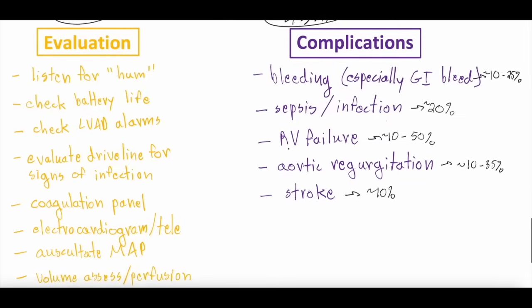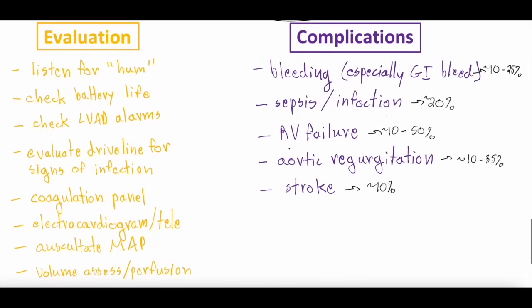All right, so how do we evaluate an LVAD? This is really complex, and this is certainly not a comprehensive list, but when an LVAD comes into the clinic, or you see one in the emergency department, and you are curious how to evaluate it, there's a handful of things you should do. The first is always to reach out to the LVAD team. They want to be involved. They follow patients with LVADs really closely. There's usually a coordinator on call 24 hours a day, depending on the institution you're at. Call the LVAD team, let them know that an LVAD patient of theirs is at your institution, and they will probably know that patient and want to be involved.